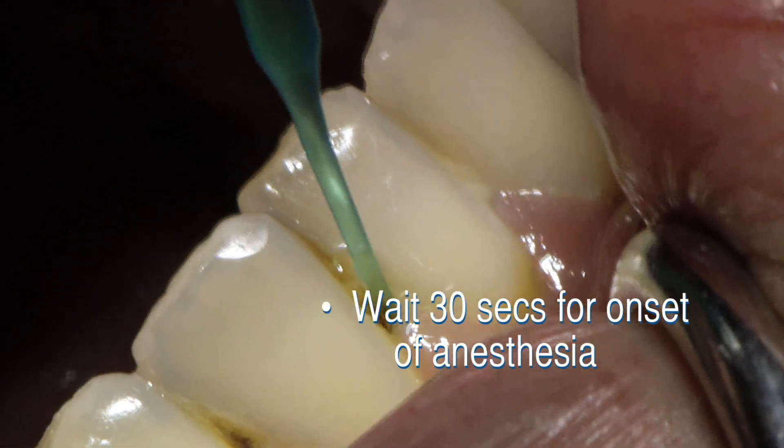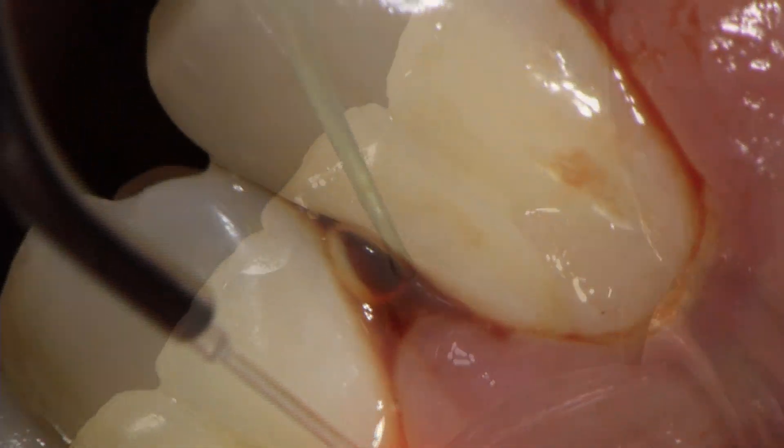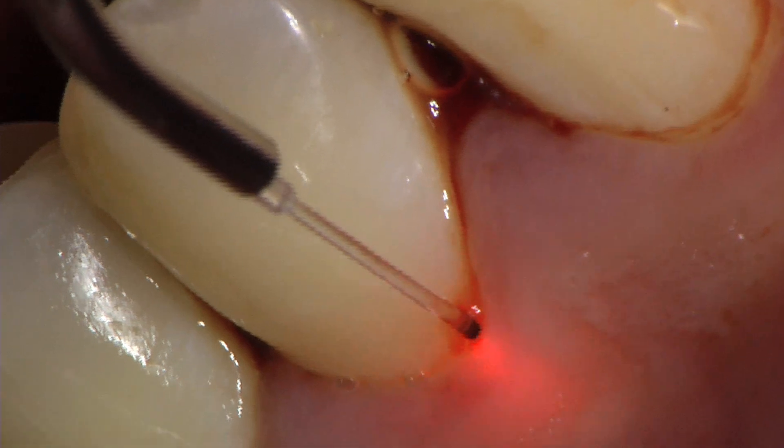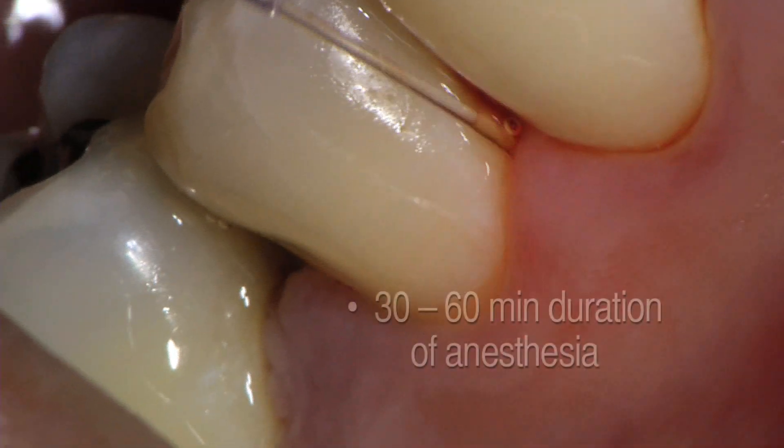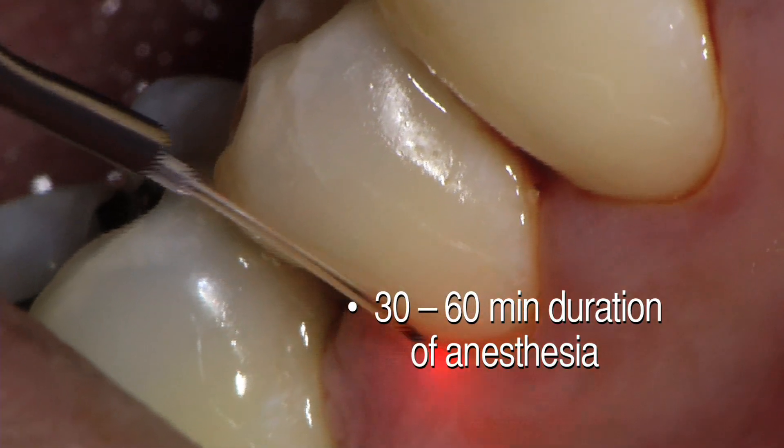Wait 30 seconds for onset of anesthesia. The area will be effectively anesthetized for 30 to 60 minutes, allowing for thorough debridement with a diode laser.